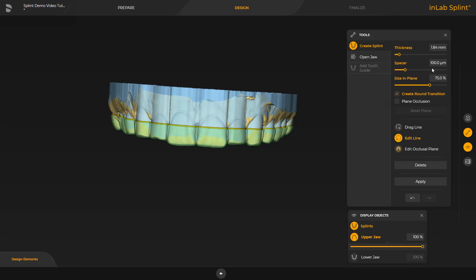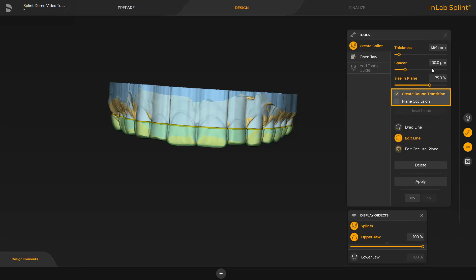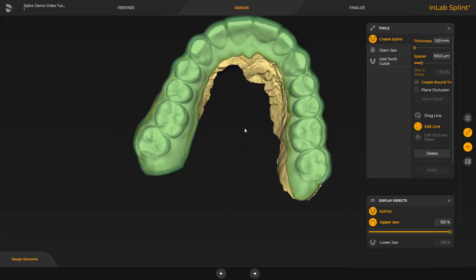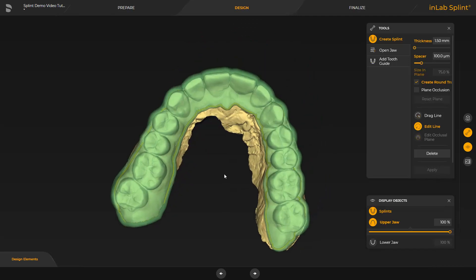At this point, different tools and options are available. To optimize the line, the currently enabled Edit Line tool can be used, or the Drag Line option above it can be selected. Additionally, we checked the Create Round Transition option so that the edges will be rounded. By enabling Plane Occlusion, a flat and plane occlusion will be created. To initiate the final splint calculation, we confirm again by tapping Apply. At this point, we perform a manual correction palatinally, and the result you will see next.